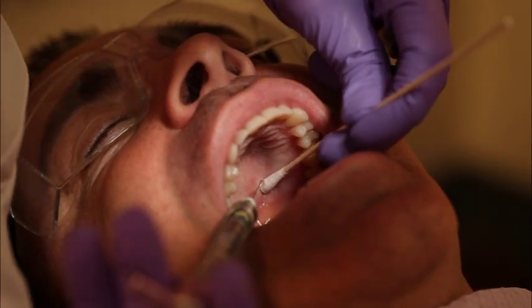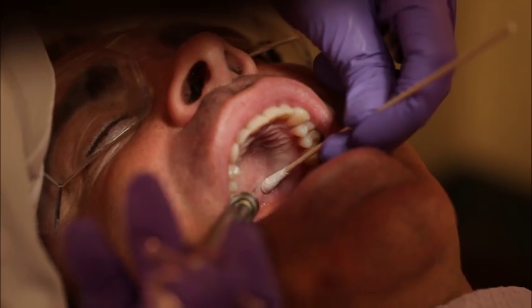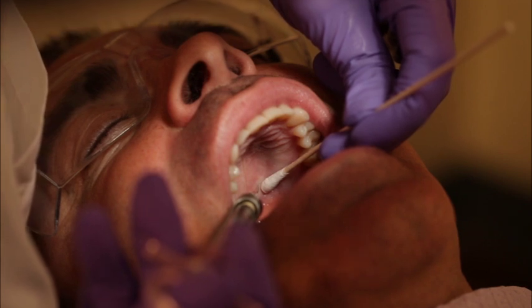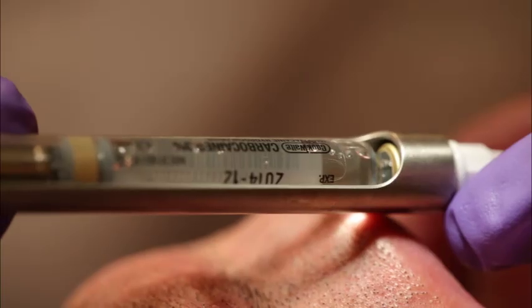Direct the syringe from the contralateral side of the mouth at a 90-degree angle to the palate toward the cotton tip applicator, with the large window facing you. Insert the needle slightly anterior to the greater palatine foramen, approximately 3 to 6 millimeters, until you contact the palatine bone, with the needle bowing slightly, while maintaining pressure on the foramen with the cotton tip applicator.